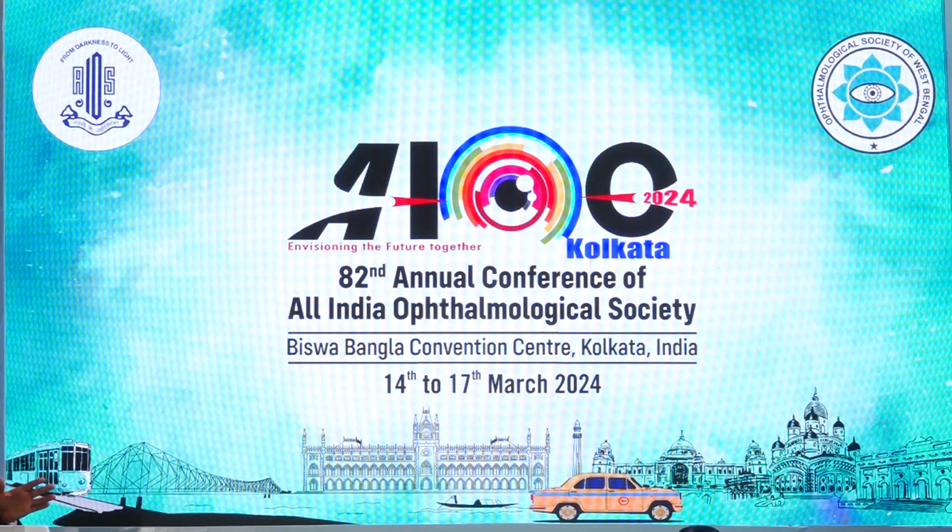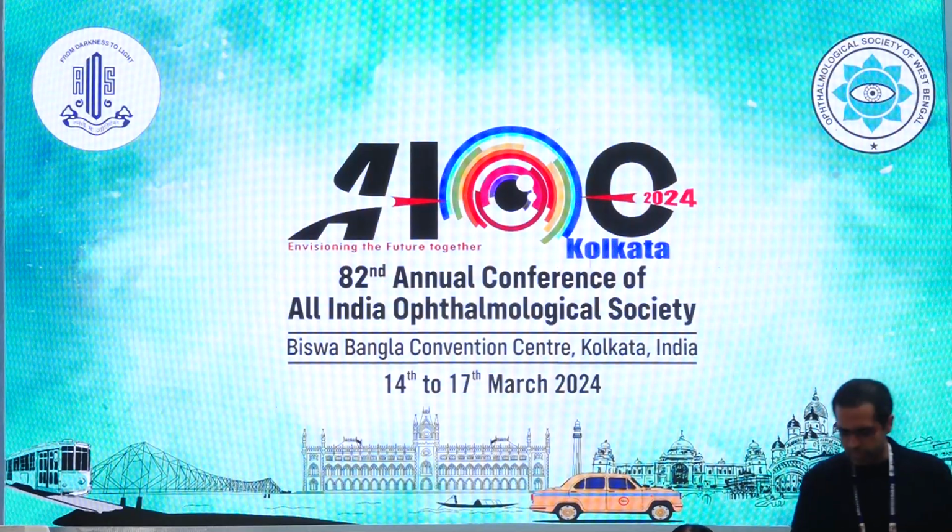There you may do a topo-guided PRK CXL, but otherwise 90% of the times, if the two things are not matching at all, which means that your Contoura planning is not matching with your manifest at all, I would go with wavefront optimized. That's the take home message. Can't force a Contoura treatment on every eye.